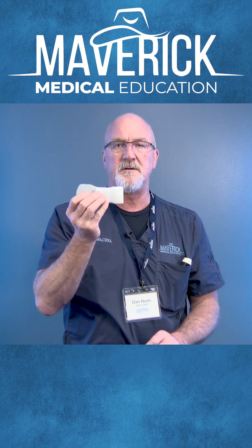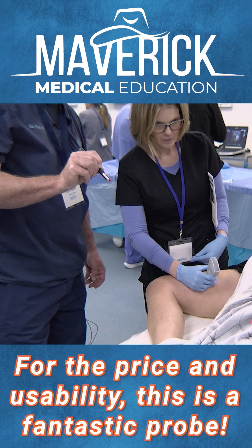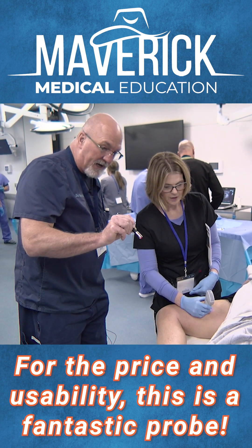The V-Scan is one of the best handhelds that I've run across in the market. We've tried several of them and we find for the price and the usability this really is a fantastic probe.